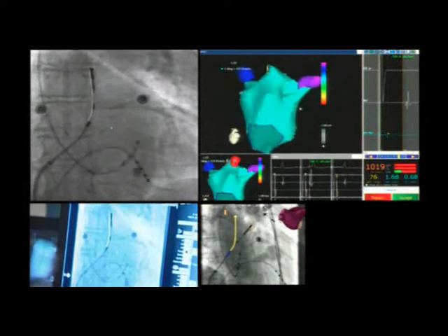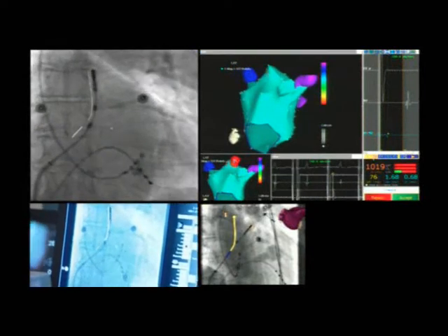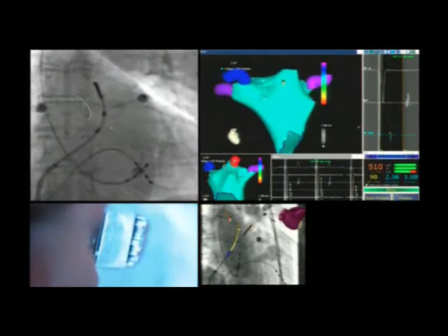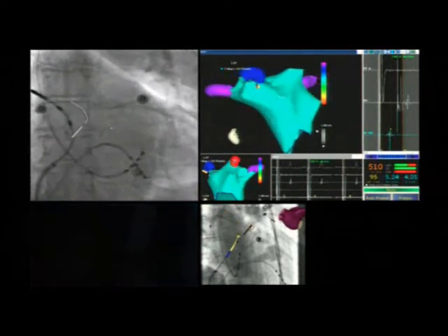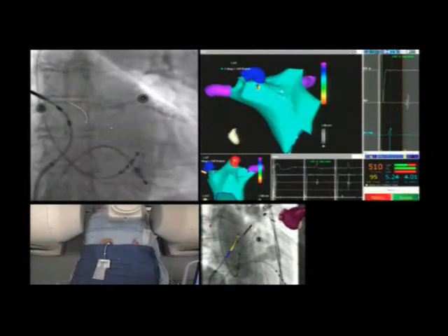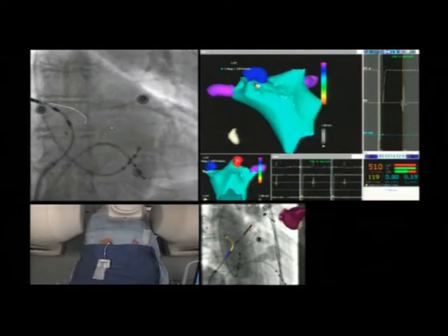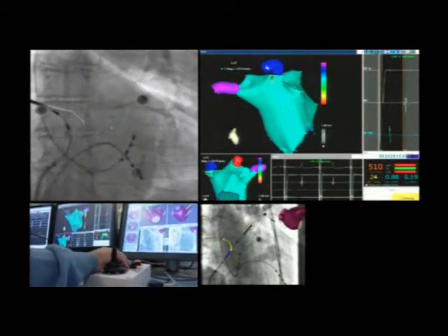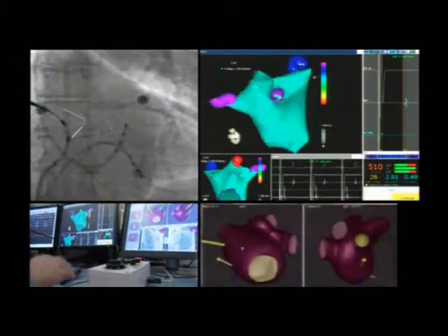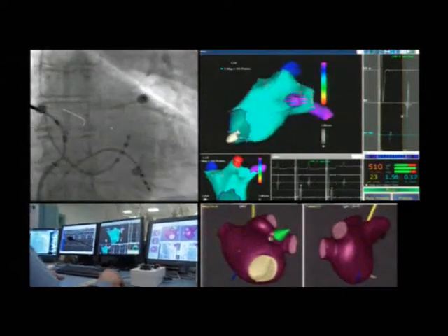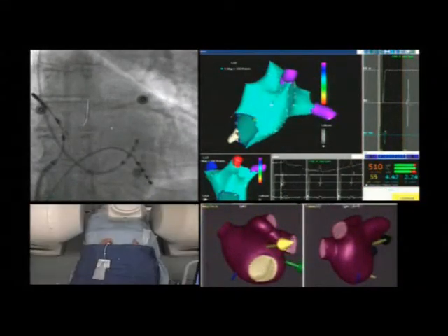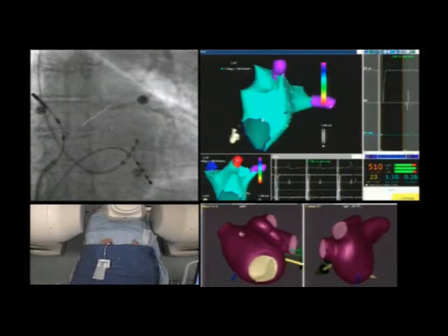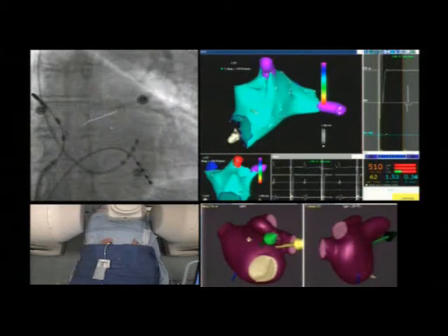The auto mapping system allows a detailed reconstruction of the left atrium as programmed by the stereo-taxis system. The system is programmed to navigate different areas of the left atrium in a standard sequence. In fact, the magnetic catheter, once the auto mapping has been turned on, is allowed to move itself within the range initially programmed by the set-up system, which is applicable for the atrial wall mapping.